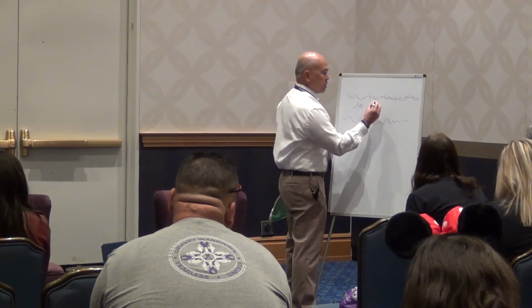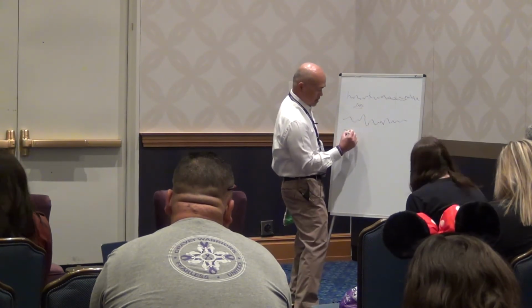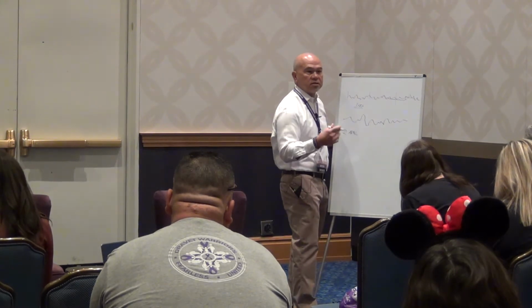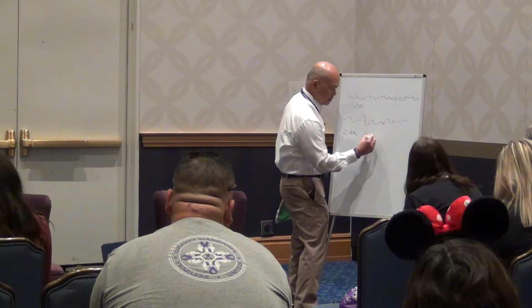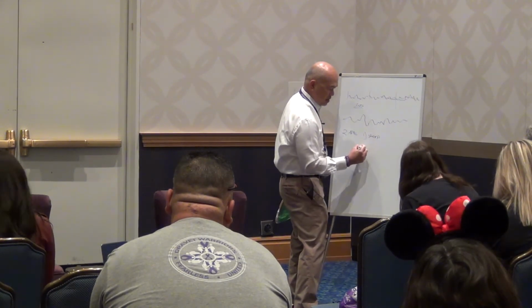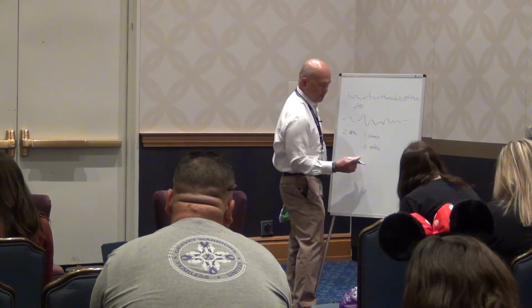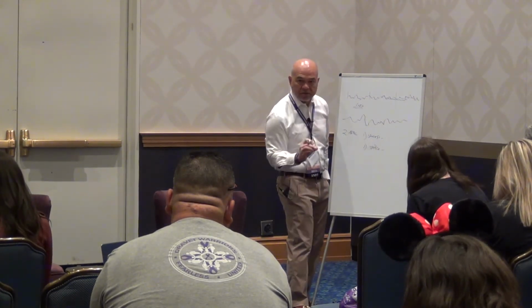So going back to her question, a spike, there are two abnormalities primarily seen in patients with tendency to have seizures. One is a sharp, the other one is called a spike. These are defined by the duration.